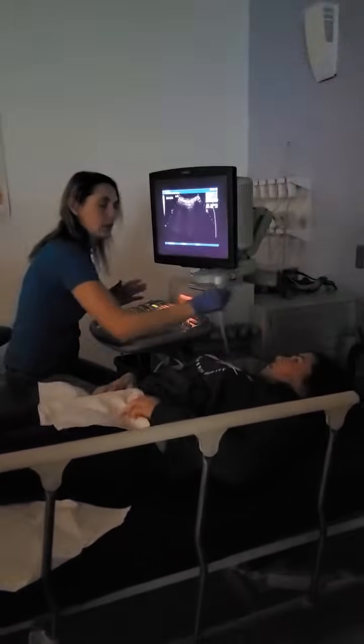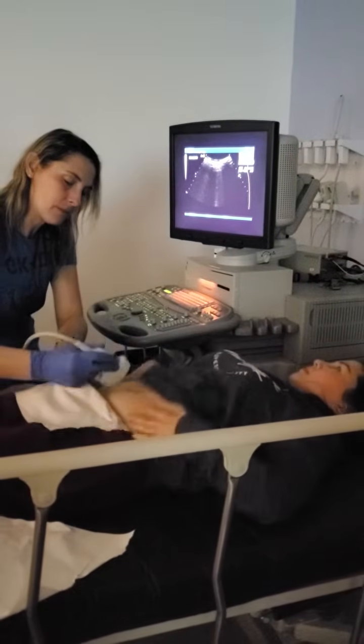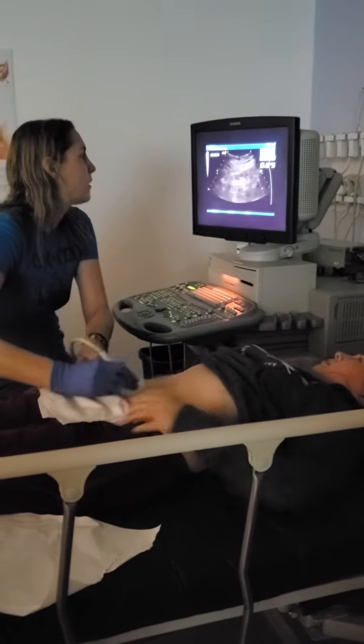Hot stuff's coming back. Okay, so we have our annotation of Sag, UB, PV. Post void. Let's back up here. Alright. Coming in hot here.